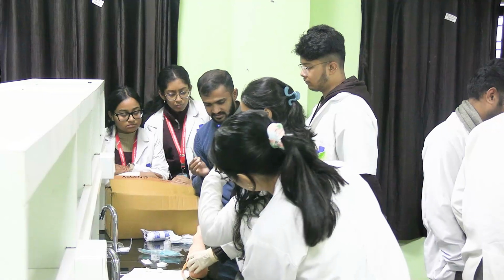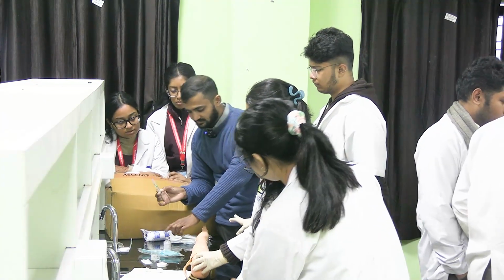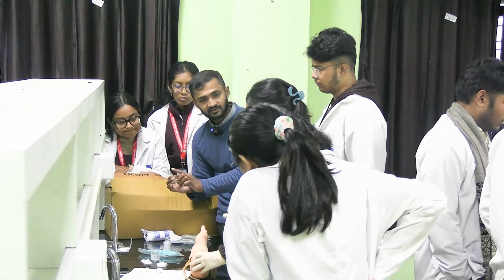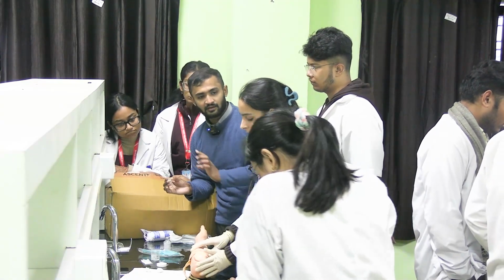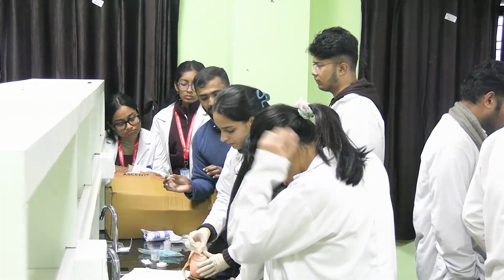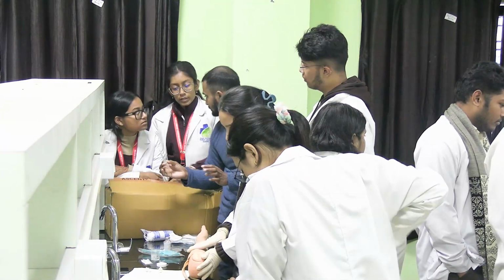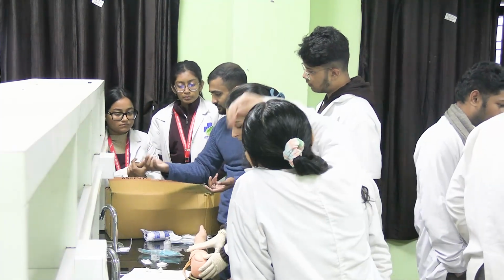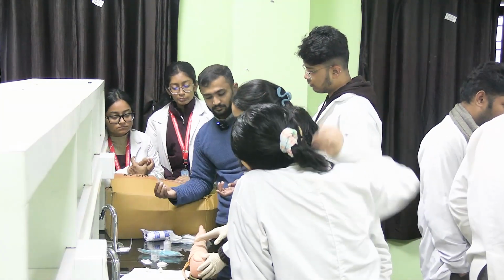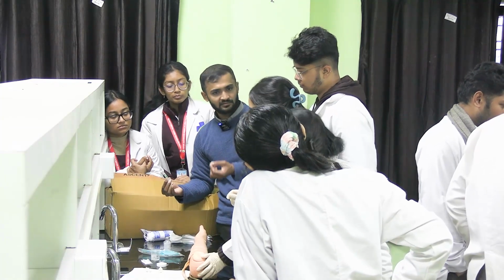So first, the hand washing is done, gloves are worn, the labels are fine. You have made the medicine ready. Now this is ready to be injected. You have located the site. Now you have to disinfect the area. In this case, take 1.1, a bit more. In all cases. Because of the same reason, a part of it is being wasted. So how much extra? 0.1. Little bit more.